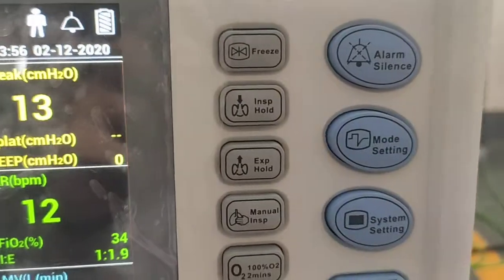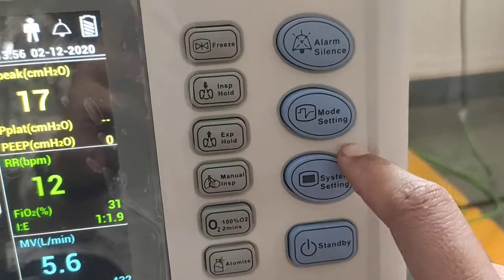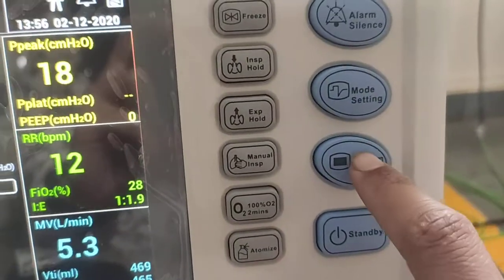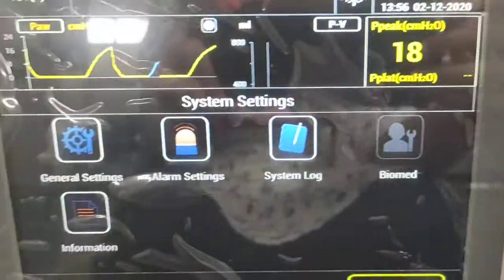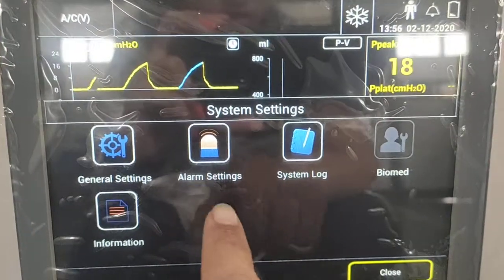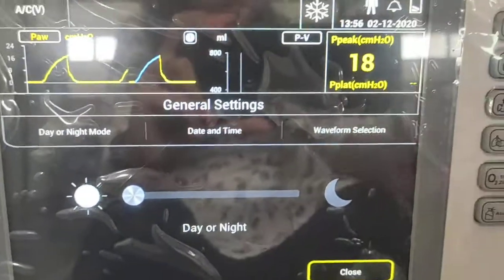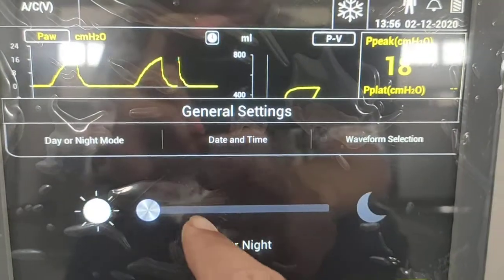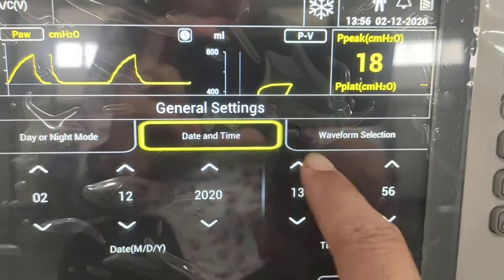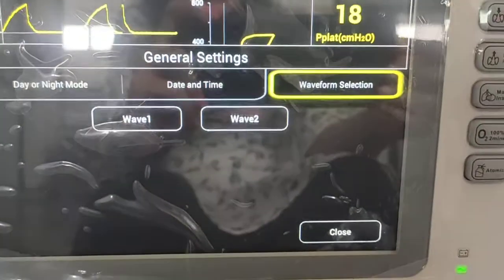Alarm silence is available to silence particular alarms. In system settings, there are general settings, alarm settings, and system logs. In general settings, you can select the mode of the machine, adjust date and time, and select the waveform pattern using the waveform selection option.